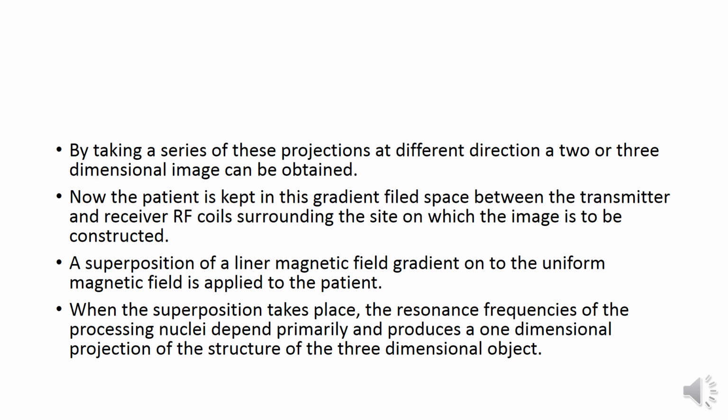In this superposition, the resonant frequency of the precessing nuclei depends primarily on the gradient and produces a one-dimensional projection of the structure of the three-dimensional object.